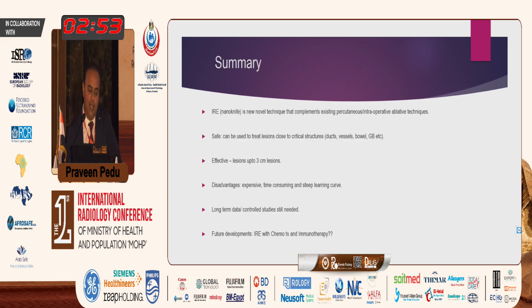Okay. And lastly, I'd like to summarize by saying that IRE is a new technique. It complements the existing percutaneous ablative techniques, and it doesn't replace any of them. It is safe to treat lesions which are close to critical structures. It's very effective when you treat tumors 3 centimeters or less. Anything more than that, higher rate for recurrence.